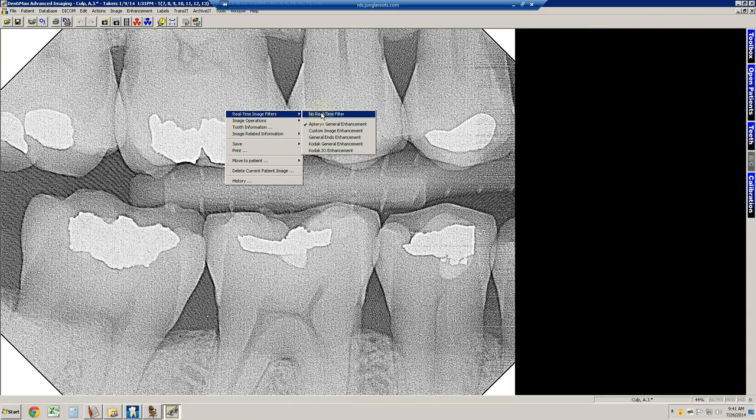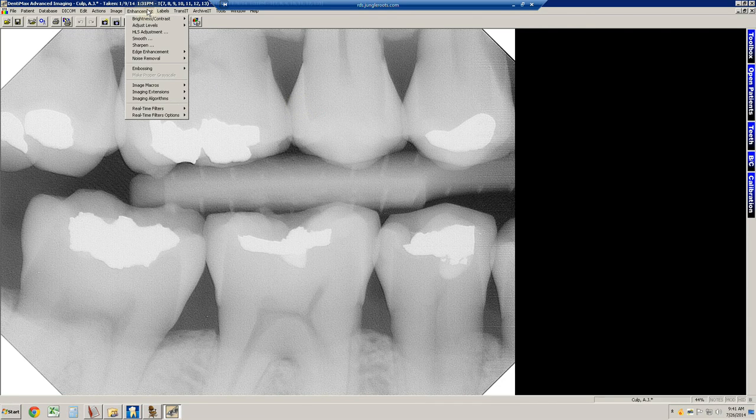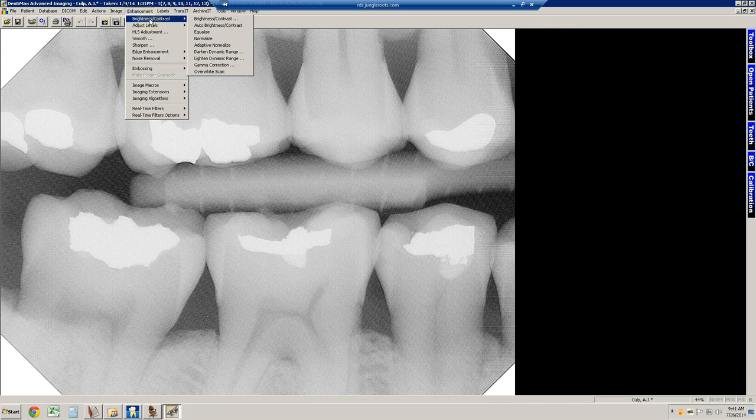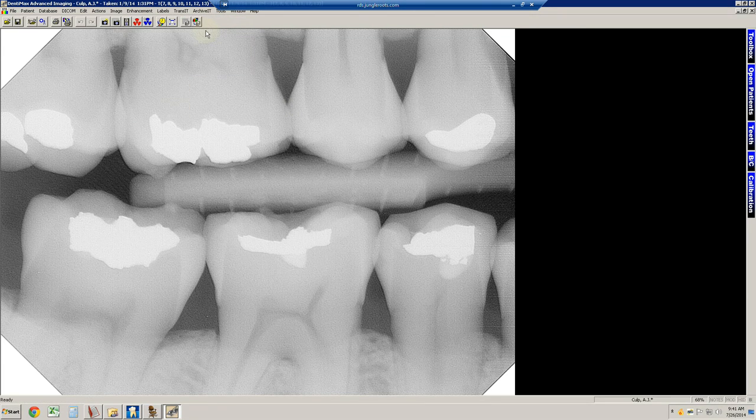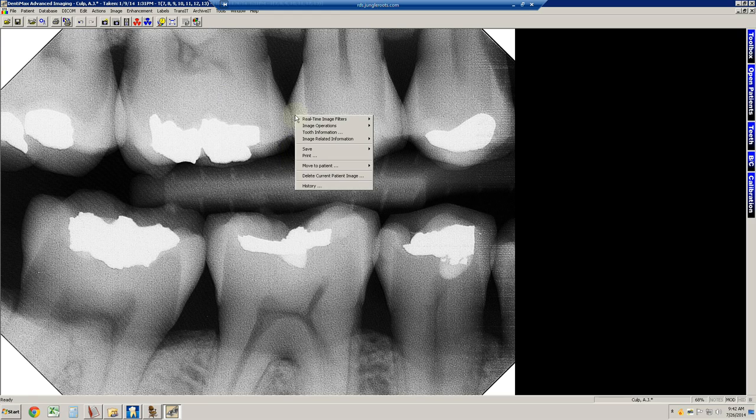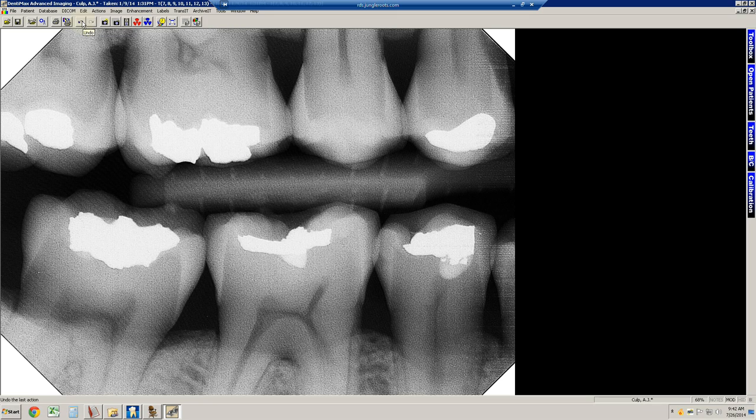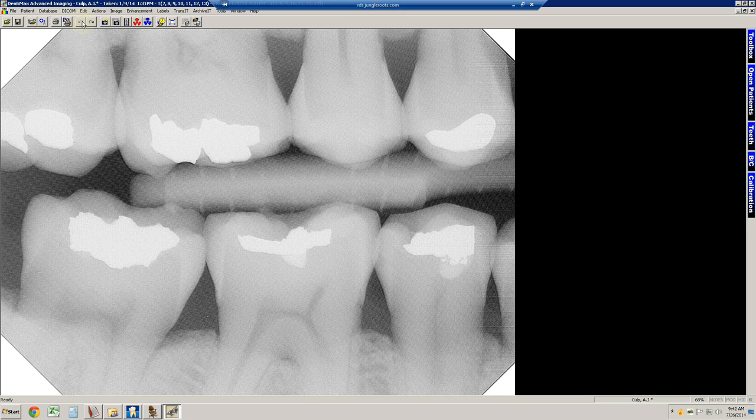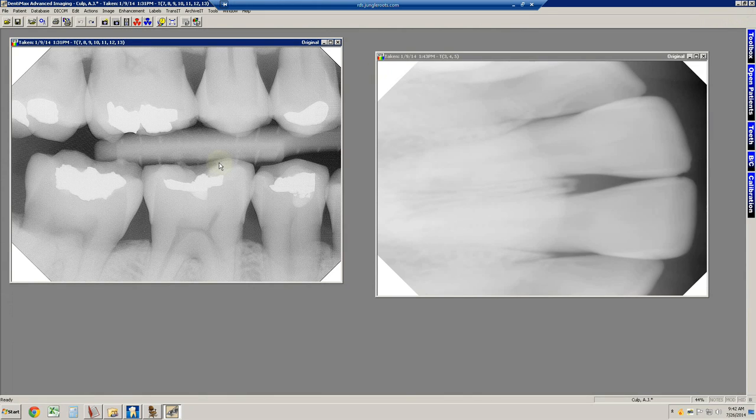We're going to do an enhancement, brightness, contrast, and then we're going to equalize it. Let's see what that looks like. That's still pretty crummy. Not a great X-ray to be manipulating. Generally speaking, there's not a whole lot in this particular issue you need to worry about, but I just thought I'd show you the different opportunities there. If you do something and you don't like the results, you can just hit the Undo button, and it'll take it back to where it was before. Let's make this a little smaller, and this is appropriate as it relates to manipulation of an image.